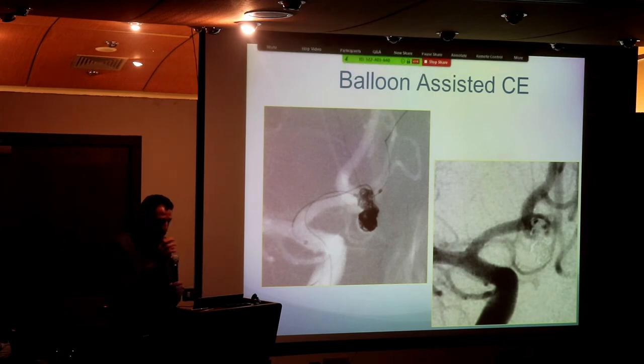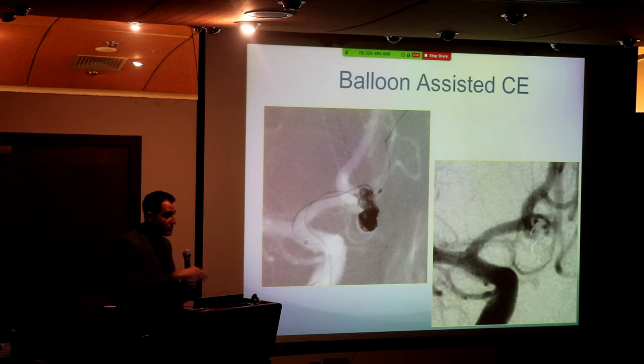Dr. Ibrahim mentioned a case when there was a rupture during a procedure. I'm not able to open the brain and control it, but I have a balloon sitting in the artery. If I have a rupture, and we could have a rupture during coiling, I will inflate the balloon and control the situation immediately. Do you have a number of how many times you coil? Every time we know how many coils, but based on the size of the aneurysm, you have to keep filling it until no more blood is there.